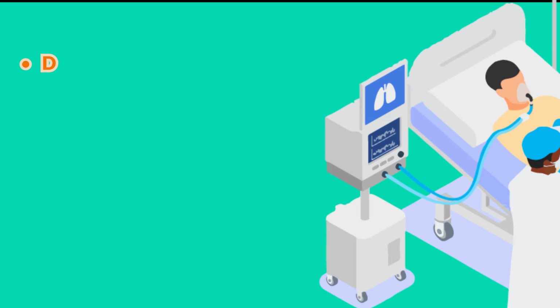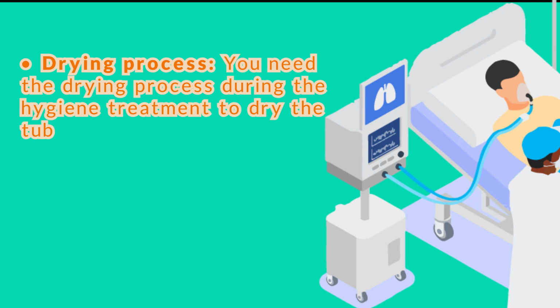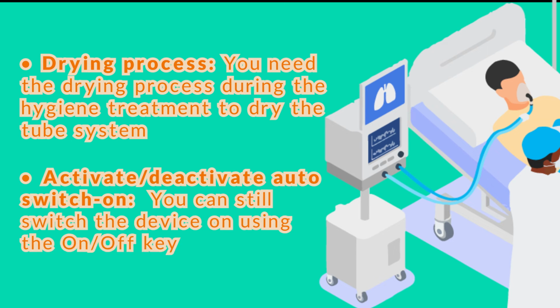Functions in the menu. Drying process. You need the drying process during the hygiene treatment to dry the tube system. Activate, deactivate auto switch on. Auto switch on switches on the device automatically as soon as you start breathing through the mask. You can still switch the device on using the on-off key.